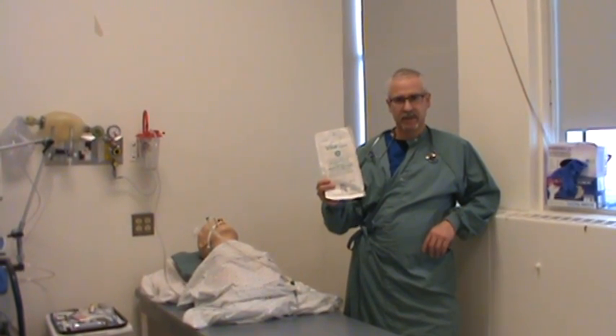Sterile gloves. Find the size that you need. I use a 7.5, sometimes a size 8, but typically a 7.5 is good for me. Find the size of gloves that fits your hand the best, because the tighter they are, probably the better fitting they are, and the better chance you have to put these on and do whatever you need to do through sterile technique.